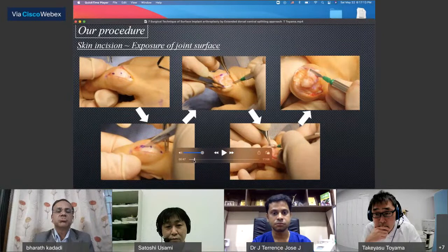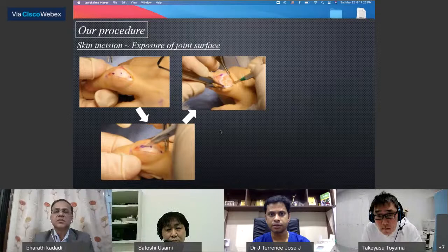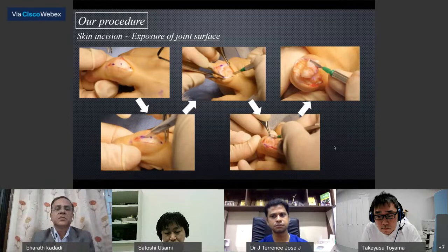A midline incision is made on the dorsal side of the PIP to expose the extensor mechanism. A midline incision is made on the central cord to enter the joint, and the attachment of the central cord and soft tissue are peeled from the bone, like peeling a fruit. At this point, care is taken not to disturb any continuity of the collateral ligament.